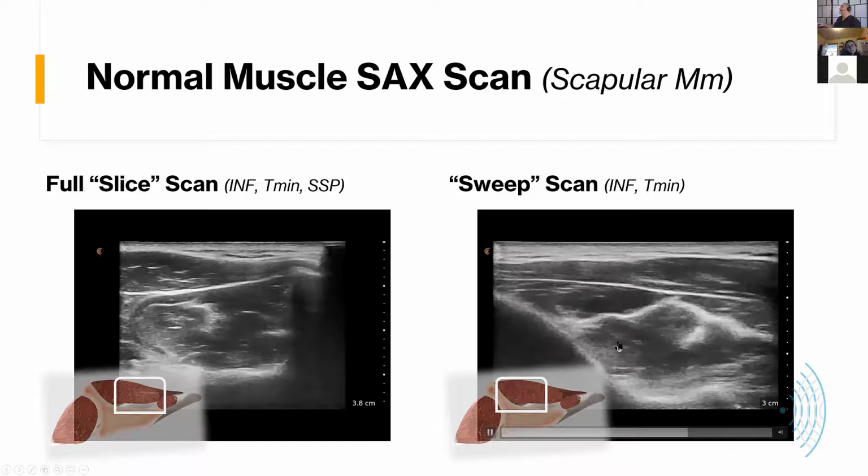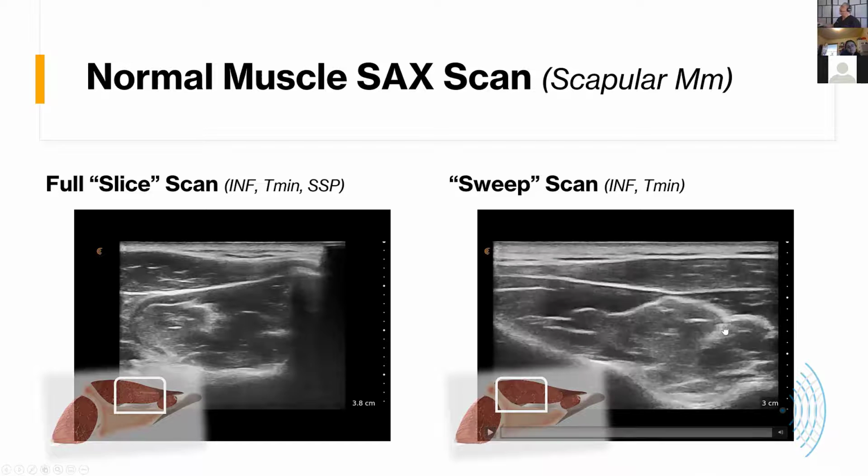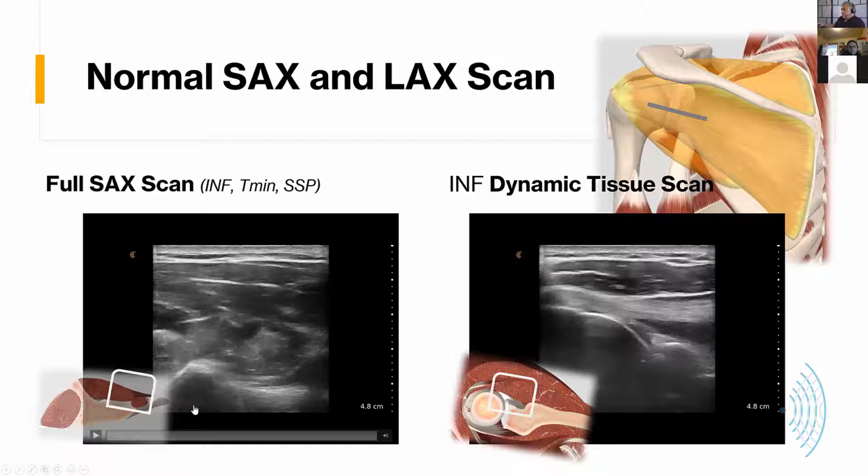This is the infraspinatus. It comes down as well, and you can see that I've gone back and forth on the infraspinatus, and this aponeurosis right here is coming down, and it will become a tendon entirely, and that tendon will insert onto the middle facet of the head of the humerus. And so that you know the orientation, above the infraspinatus, this muscle here is the deltoid muscle. Now, let me see if I can move on to the next slide here.